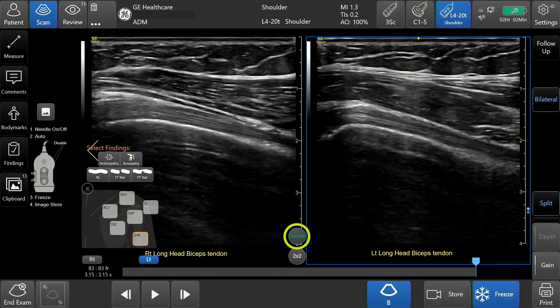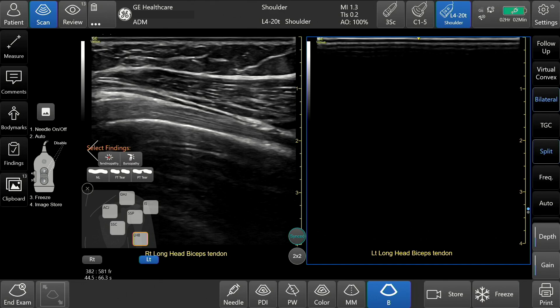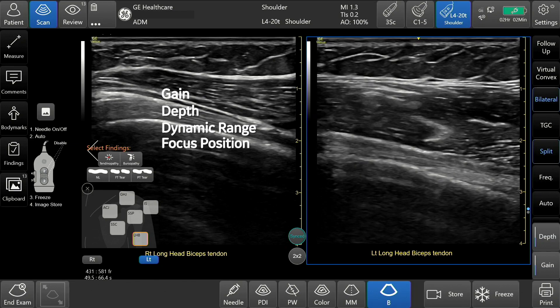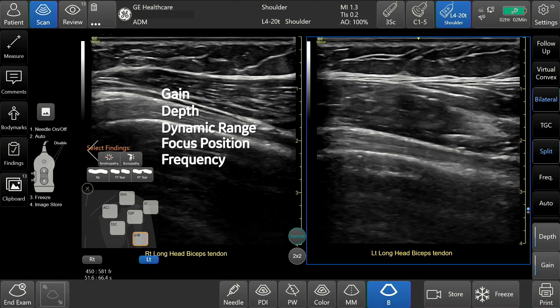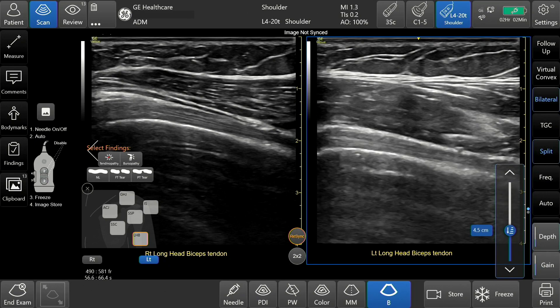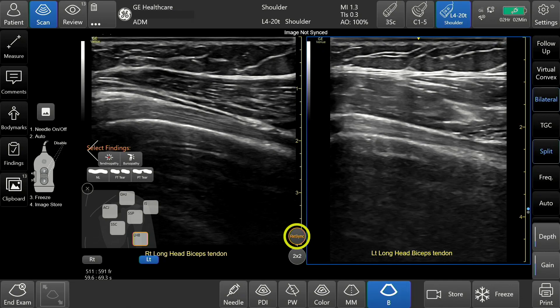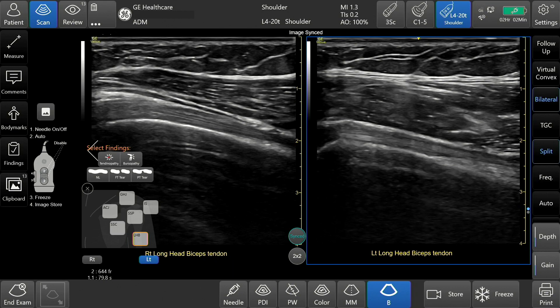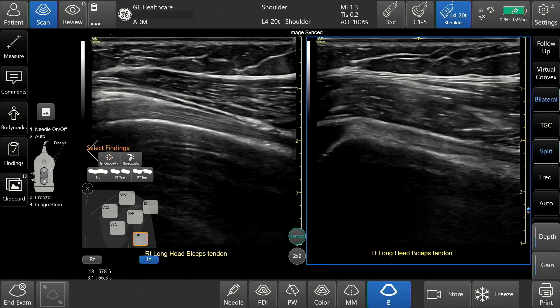Bilateral mode allows a synced option. Synced automatically reloads the scanning parameters from the selected stored image and applies them to the live scanning image which appears on the other side of the screen. Synced parameters include gain, depth, dynamic range, focus position, and frequency. During live scanning, changing parameters can be adjusted as needed at any time. To re-sync the images and return to the original settings, tap re-sync. The system does not sync labels, body marks, or annotations.